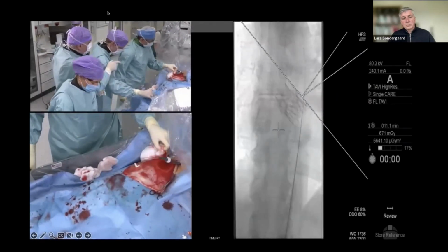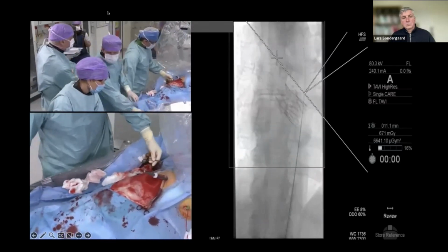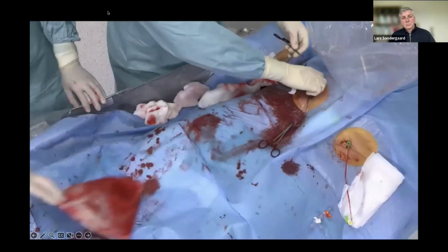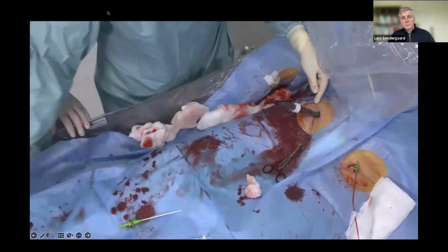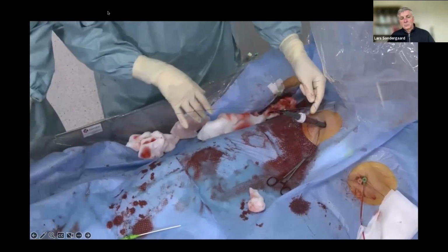Again, Gintas, just explain to us your strategy for vascular closure. Yeah, so in this particular case, we used 2 ProGlide. I very often use just one, but here it was a less certain puncture due to the depth of the puncture. So just in case, we used 2. I think I will start with just closing one initially. We will move out with the knot pusher. Yeah, we will move out with the big sheath. We will see how it looks like.